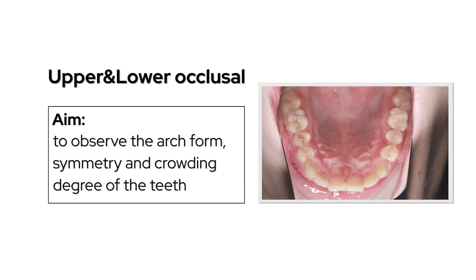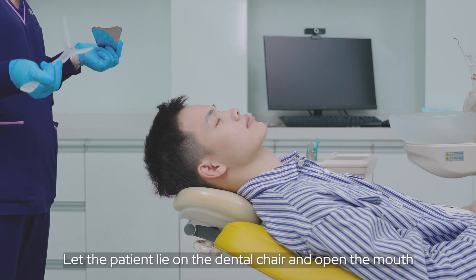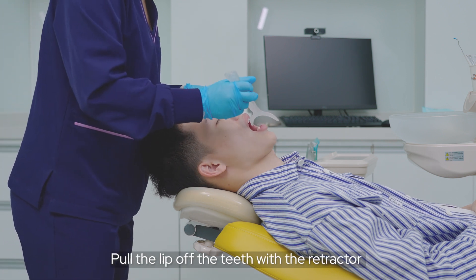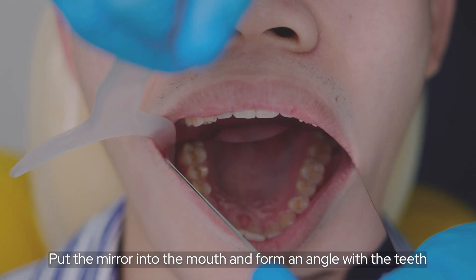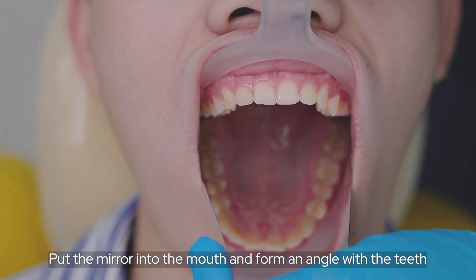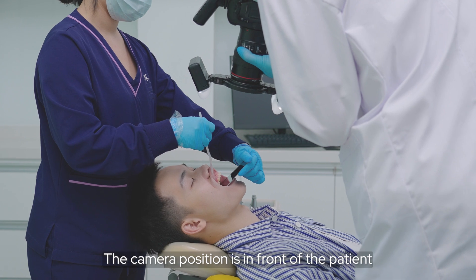For the upper and lower occlusal view, observe the arch form, symmetry, and crowding degree of the teeth. Let the patient lie on the dental chair and open the mouth. Pull the lips off the teeth with the retractor. Put the mirror into the mouth and form an angle with the teeth. The camera position is in front of the patient.